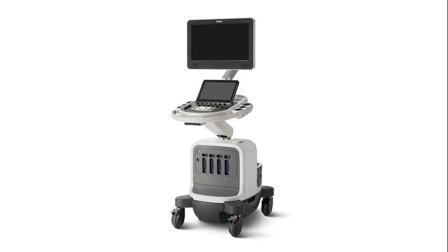On the 12-month CT, if the aneurysm appears stable or begins to shrink, the patient may be followed with annual duplex imaging from that point on. Another CT scan is not required until 5 years post-procedure.